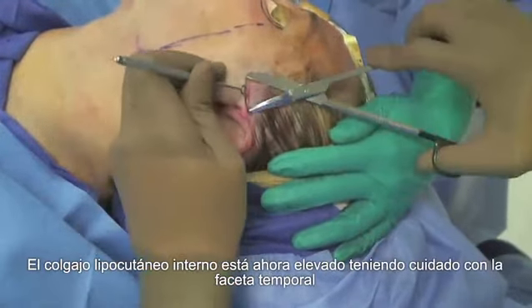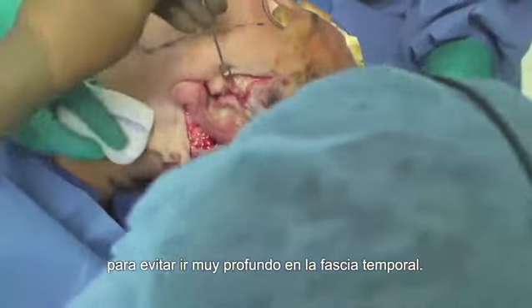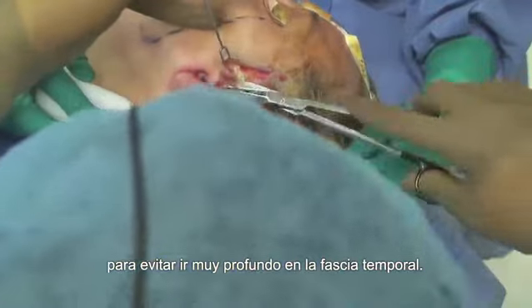The anterior lipocutaneous flap is now elevated, taking care over the temporal fossa to prevent entry deep to the superficial temporal parietal fascia.